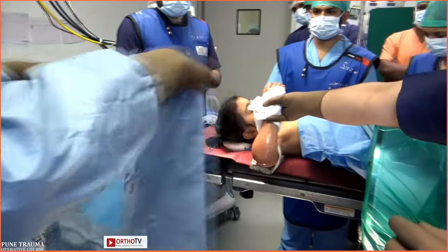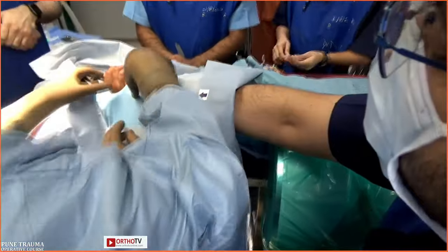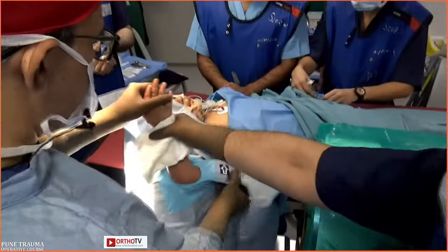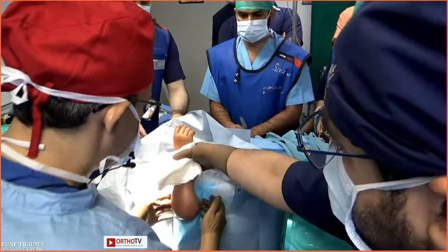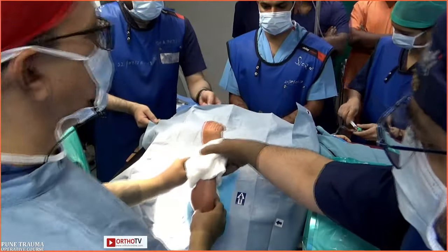And we have heard. Sandeep knew that question was coming. Yeah, and he had prepared it at night. So this is the O drape. I have a nice disposable O drape which I put around. So Sandeep, is that a hole drape or O drape? There's an O, there's a hole there, that's all.